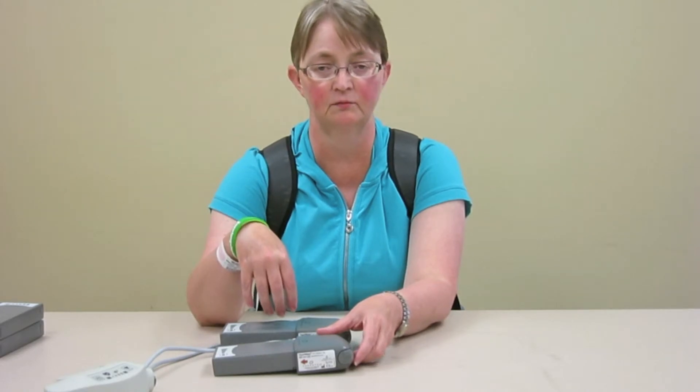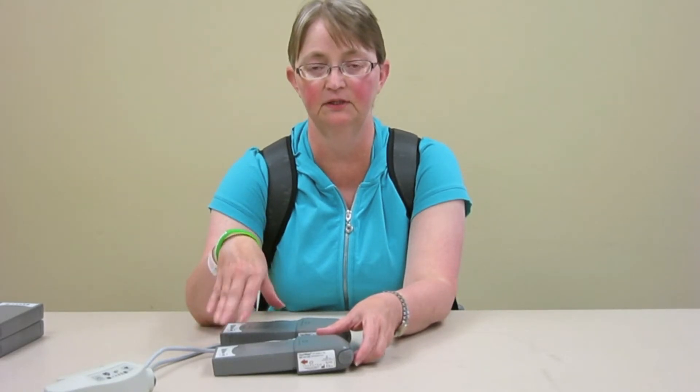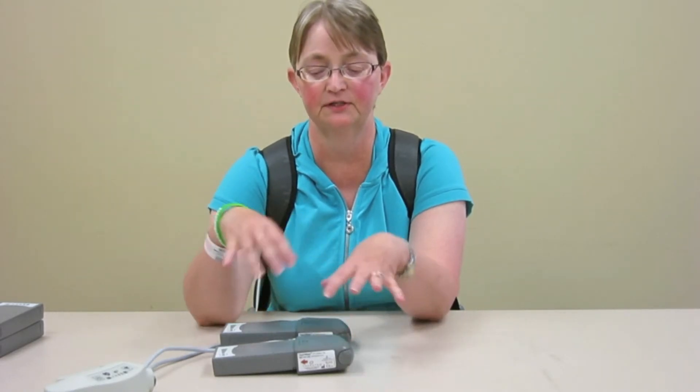Always change both batteries. Don't just change one if one is almost depleted and the other has a little bit left. Always change both batteries, because then you know you've got a fresh start for a long time.